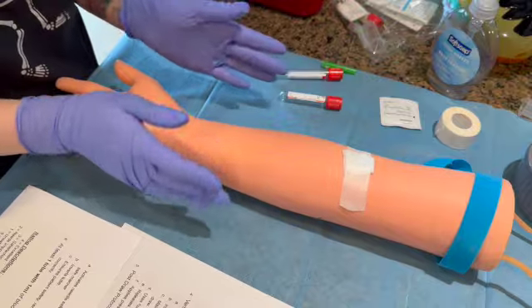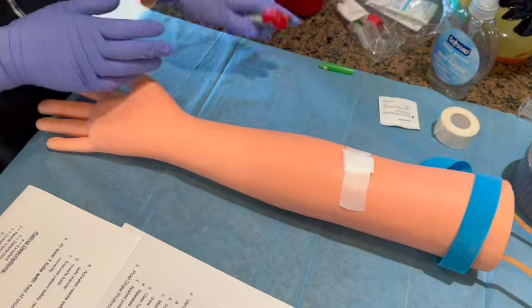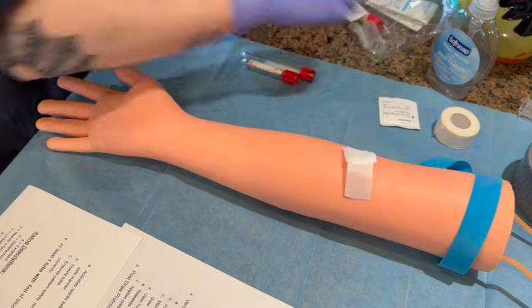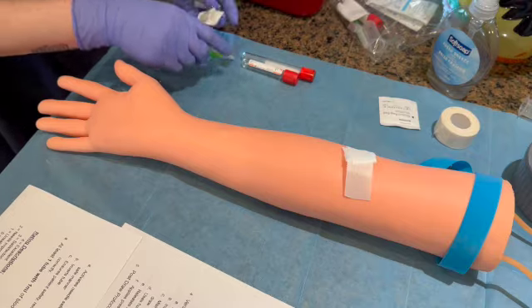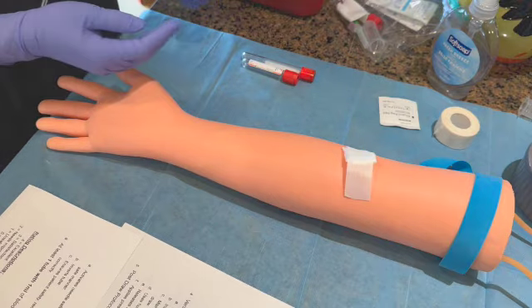We're going to also make sure that our patient is safe. We've got our tubes of blood, and we're going to make sure that we dispose of all materials correctly. So that means taking all of our stuff, if it hasn't been tossed yet, putting it into the trash can, and then removing our gloves and materials, etc. And that would be your first portion for a straight needle.